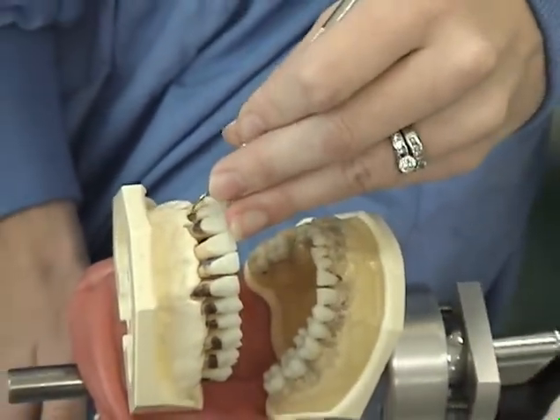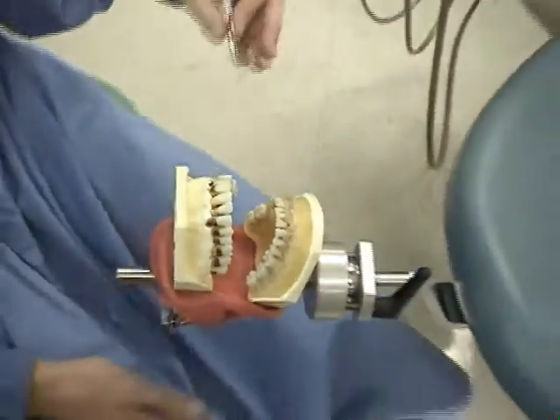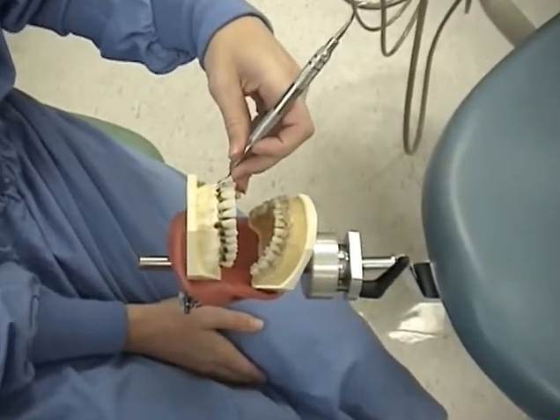Change your seating position for surfaces away from you. Starting at the midline of the tooth, complete all surfaces away from you.